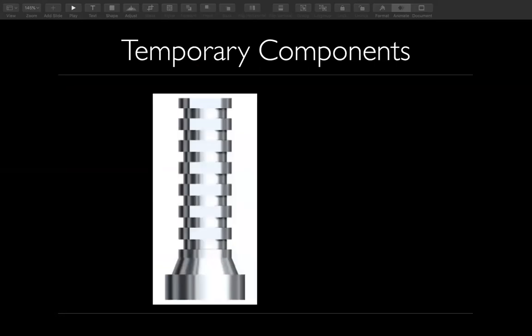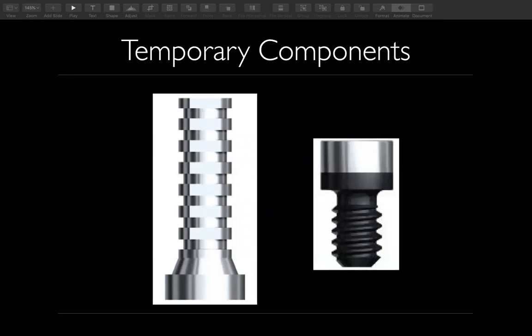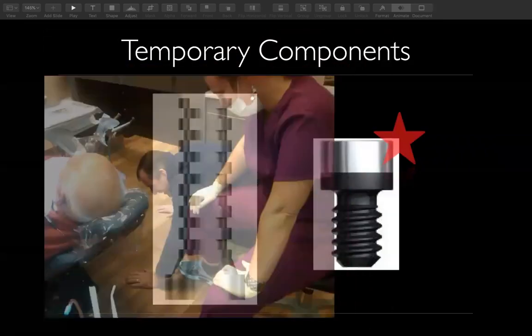This is what the temporary copings are. Typically, what I'd like to do is take these temporary copings and sandblast them before I go to the lab or to the office. That way they're prepared. I find that the acrylic seems to bond better to that. Maybe use a metal primer from GC on it. I've done them without sandblasting it, so you can do it both ways.